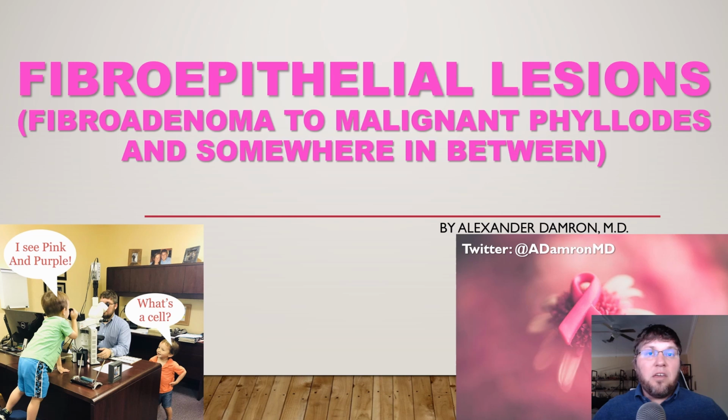So in this video, we're going to talk about fibroepithelial lesions, and I'm really going to focus on the gray zones in this diagnosis, specifically on core biopsy where it becomes challenging. Do I call this a fibroadenoma, cellular fibroadenoma, or potentially a cellular fibroepithelial lesion that may need excision, right? So we're going to touch on those gray zones to hopefully give you my systematic approach to these lesions, particularly on core biopsy, where I think they're the most challenging.